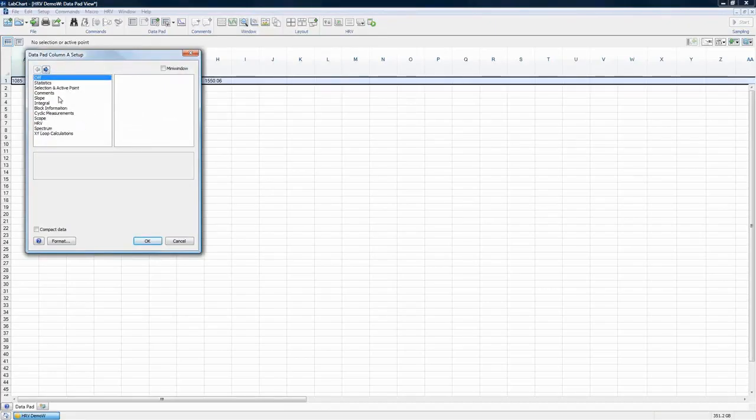So the left hand side here will be overarching topics, cyclic measurements, statistics, etc. If we click on that, it gives us our subtopics, things we can calculate in that column that relate to a specific overarching analysis like HRV or cyclic measurements. So as you can see, a lot of what you have out here in the report view can also be displayed here as a spreadsheet.